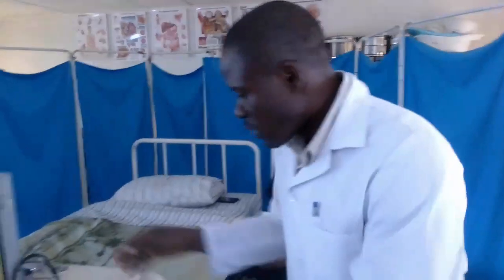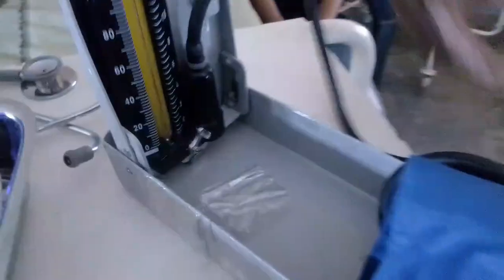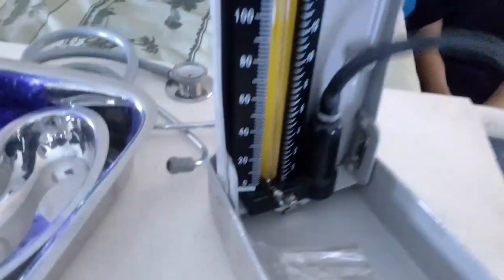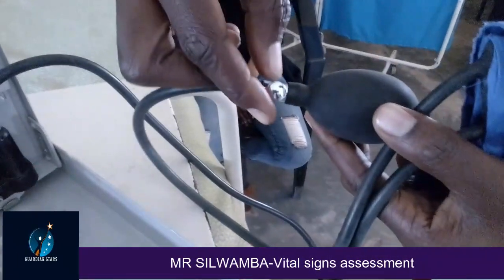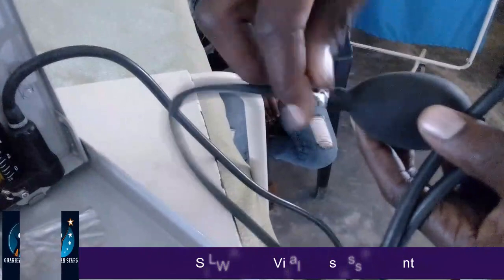So here we go. Let's look at the sphygmo. The sphygmo has this button. We're going to shift it either off or on. When it's off and you try to pump, the mercury won't rise because it's off. But let's say we turn it on. What happens? The mercury is still not rising, so there should be a knob somewhere. This knob will control it. You close it like that. They have turned it on, but you try to pump and nothing is happening.